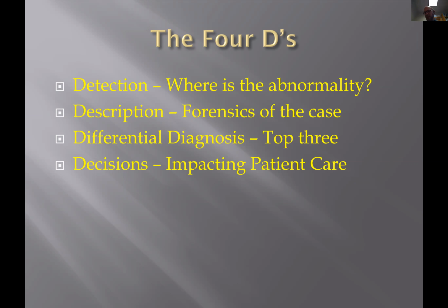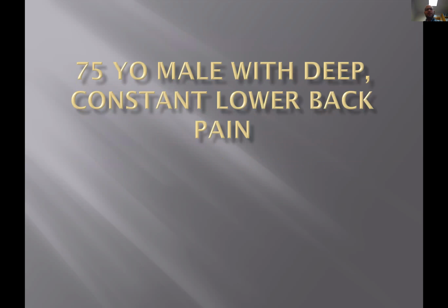Okay. First case. 75-year-old male with deep, constant lower back pain. Deep, constant lower back pain. All right, now I'm not gonna flip to the picture yet, but when I do, you're gonna see it pretty fast, and that's fine. That's good. I hope you do.